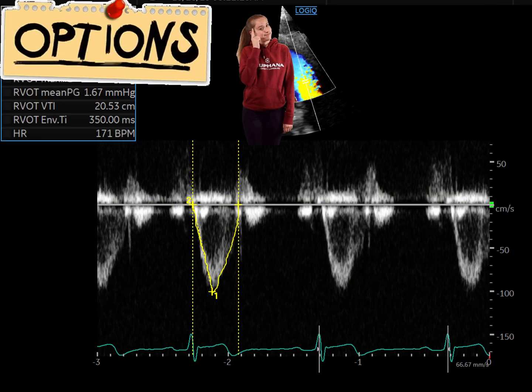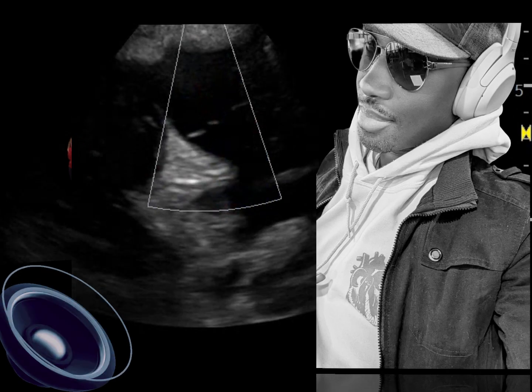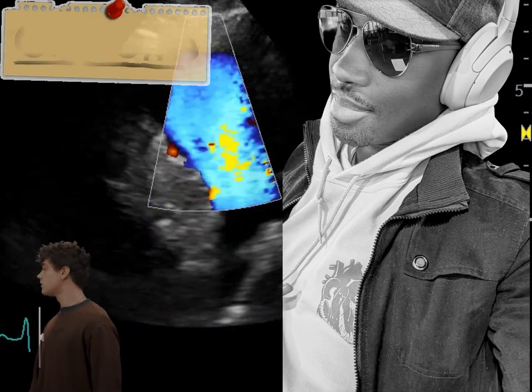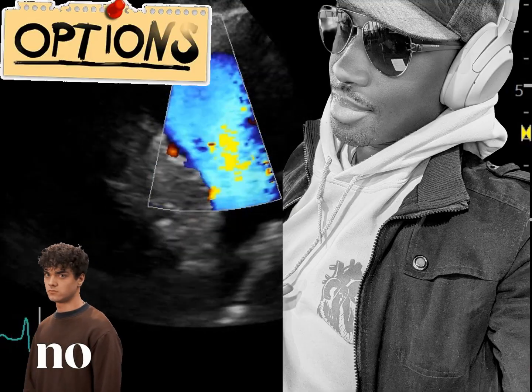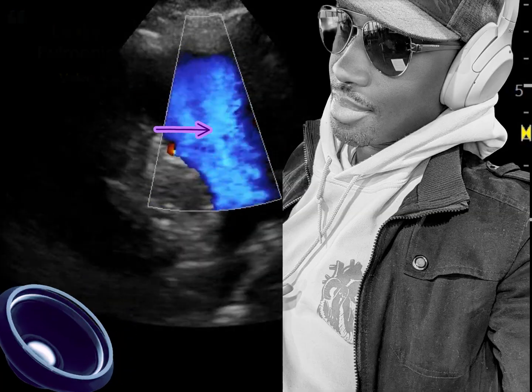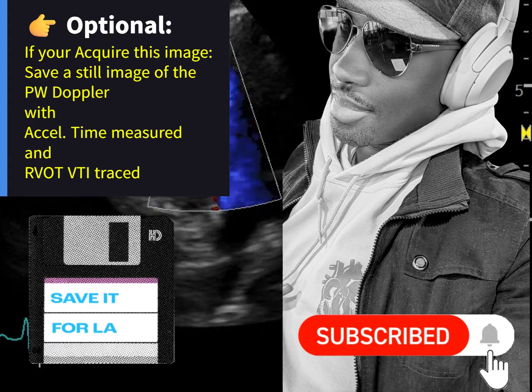Place a pulse wave Doppler at the RVOT just before you get to the valves to measure one, the RVOT VTI, and two, the pulmonic acceleration time. This is an essential indicator of pulmonary pressures. Now, some places don't have you do this, but in case they do, you want to follow that protocol. Regardless, you want to make sure you capture the pulse wave Doppler waveform just in case where you work at requires it.